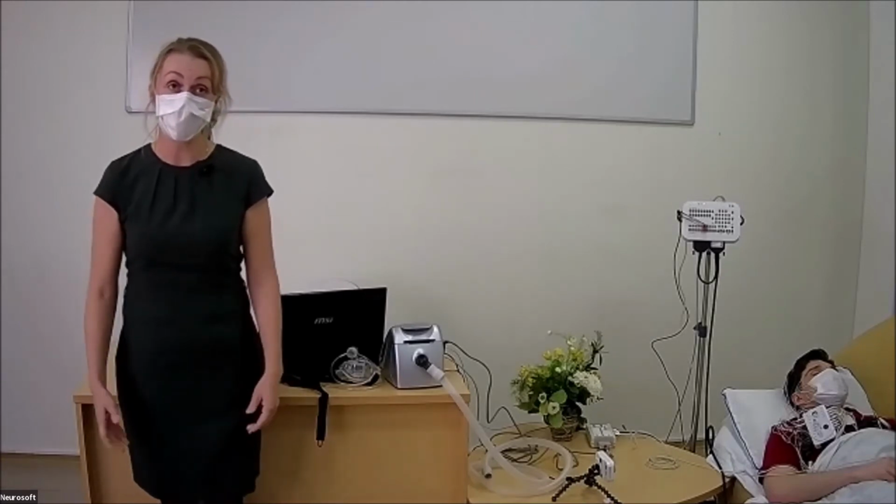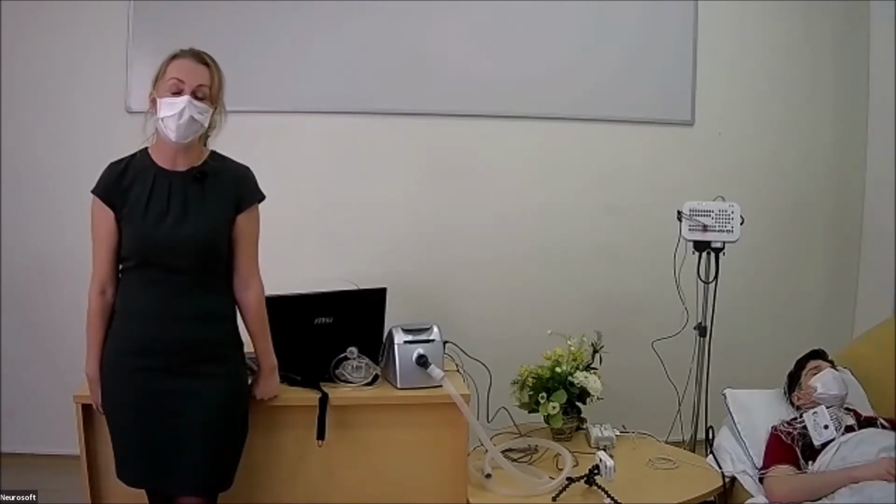Sometimes the medical specialist can recommend using auto-PAP devices, but in some cases, especially when the person has some comorbidity, we need to perform a PAP titration test in the laboratory, and we perform a manual titration PSG test.